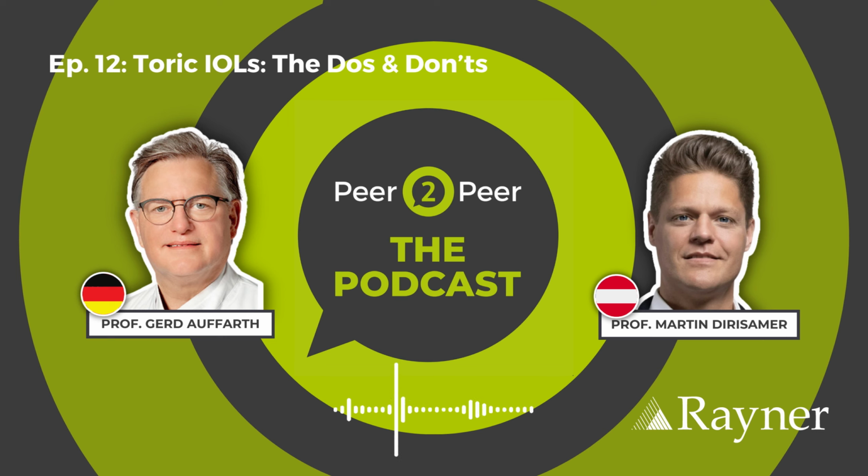both sides. Yeah, you mentioned that 30% have more than one diopter of astigmatism. So what would be the minimum correction you would use for toric IOL calculation? I mean, not all companies offer a whole range of lenses. Some even do customized lenses, but most of the companies have a fixed amount of toricity, like T1, 2, 3, 4, 5, whatever. So what is your approach?